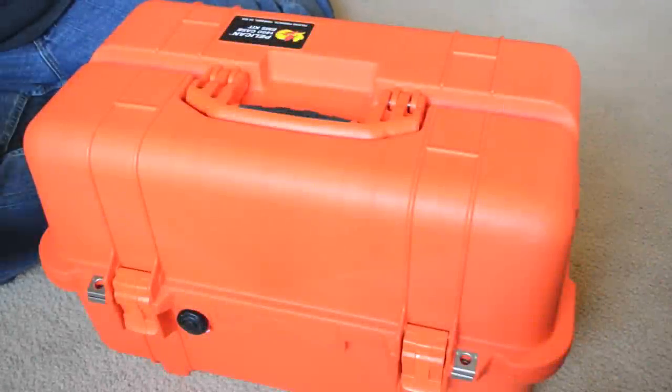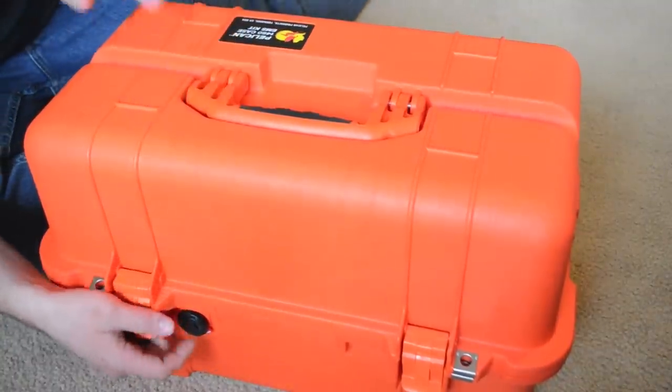Alright guys, I've gotten a lot of requests to do a video of an at-home first-aid kit. These are some of the things I've compiled — a kit that I would recommend for you guys. So let's go ahead and open the box and get started.